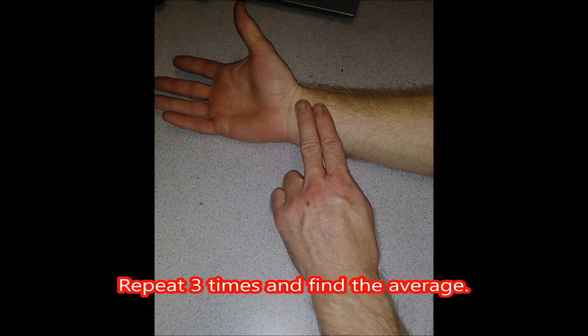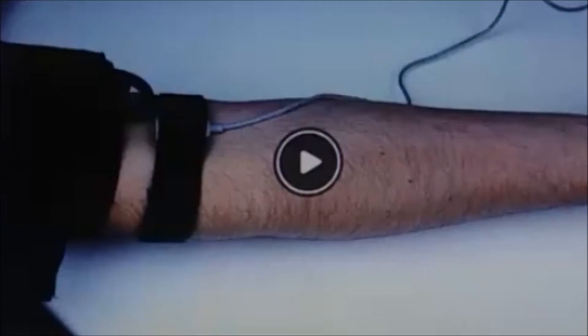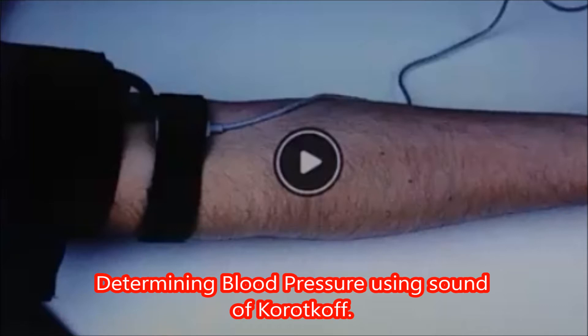Repeat three times and find the average. The following is a data table comparing radial versus apical heart rates. Next, we will be determining blood pressure with the PowerLab using sounds of Korotkoff.